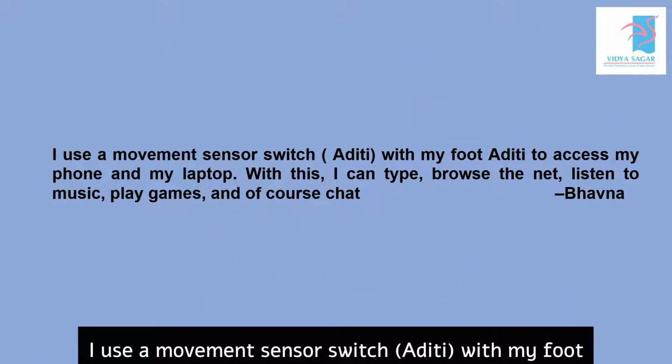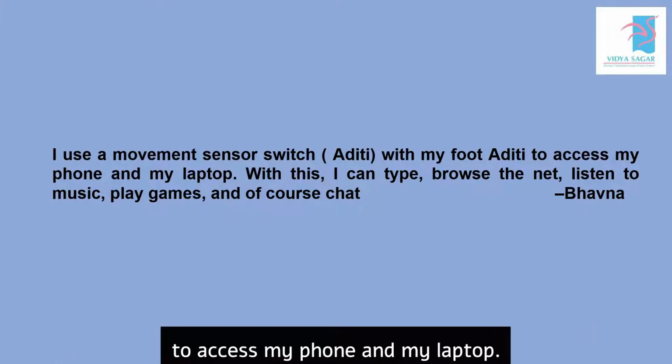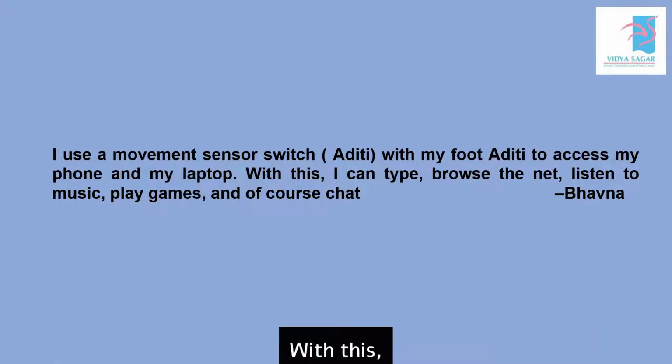I use a movement sensor switch Aditi with my foot to access my phone and my laptop. With this, I can type, browse the net, listen to music, play games and of course chat.